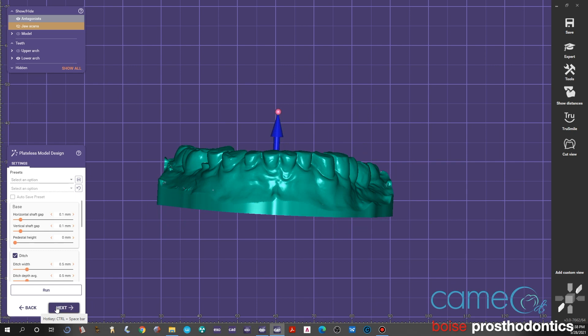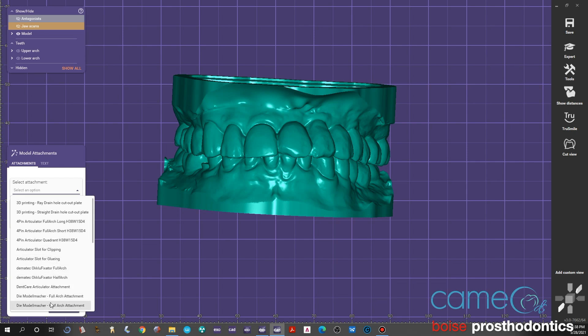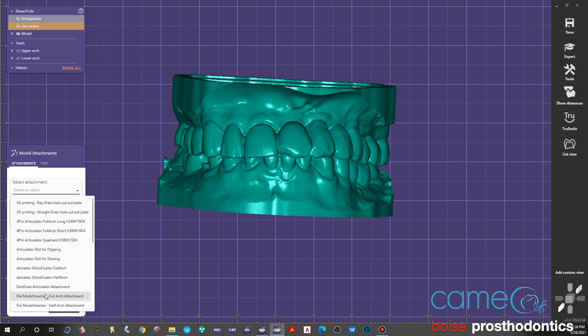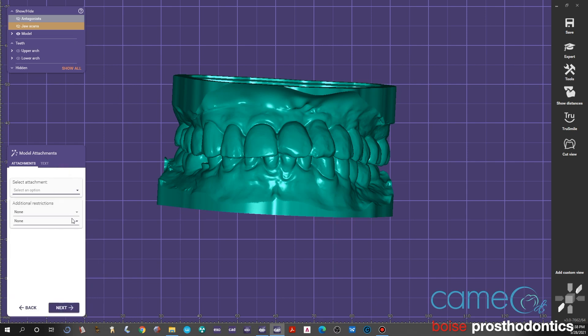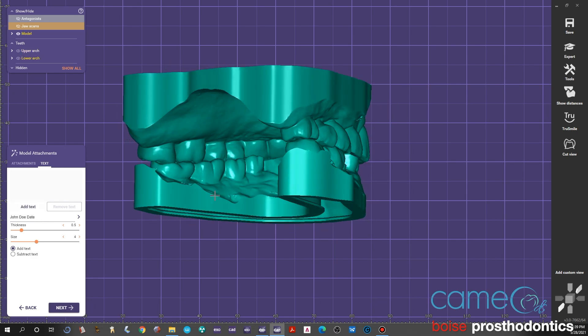At this point you can add attachments, you can add a name, you can print little supports so it has its own articulator. We don't usually do too many things like that, but you can go through all those and see how they're usable for whatever you may want. In this case we're just going to go to the text section and put on there the name. In this case it's John Doe—we'll type in John Doe and usually a date. We want to subtract that, make it negative into the model. I think it prints better that way.